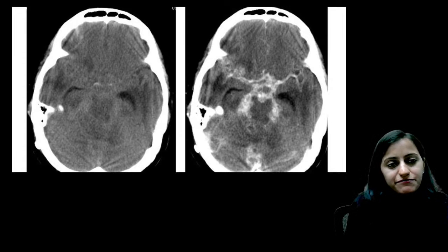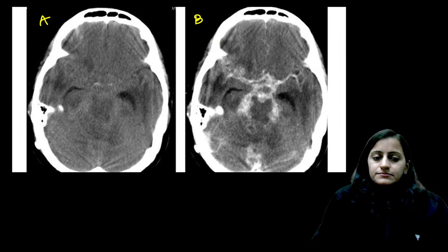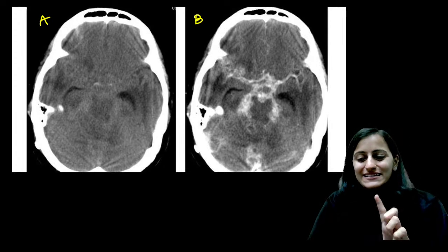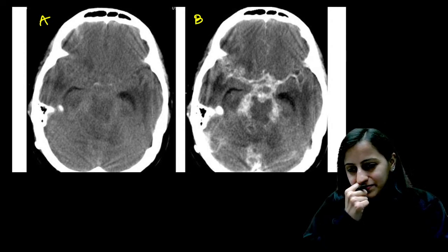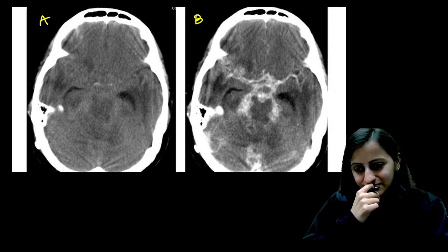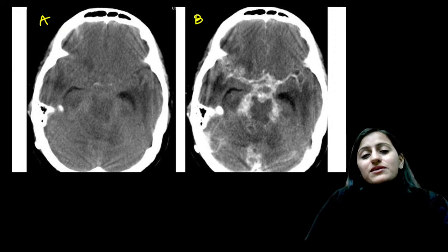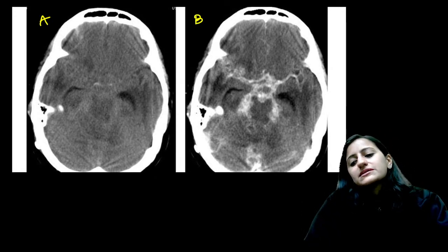Next one. Tell me the difference between the two, image A and image B. Very good. I'll come to your doubt about those white color dots in image A after I discuss this slide. I'll answer your question as well. CT contrast, remember it is iohexol. Gastrographin and urographin were used previously when iohexol was not available. Iohexol is more safe, so now we prefer using iohexol.